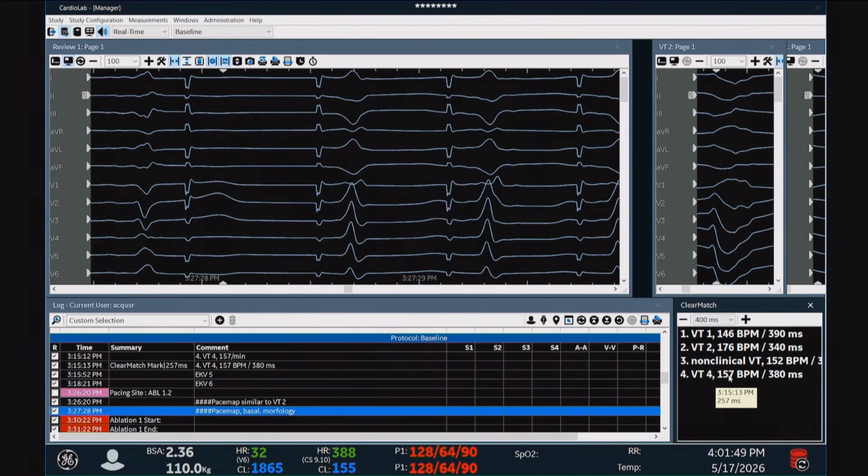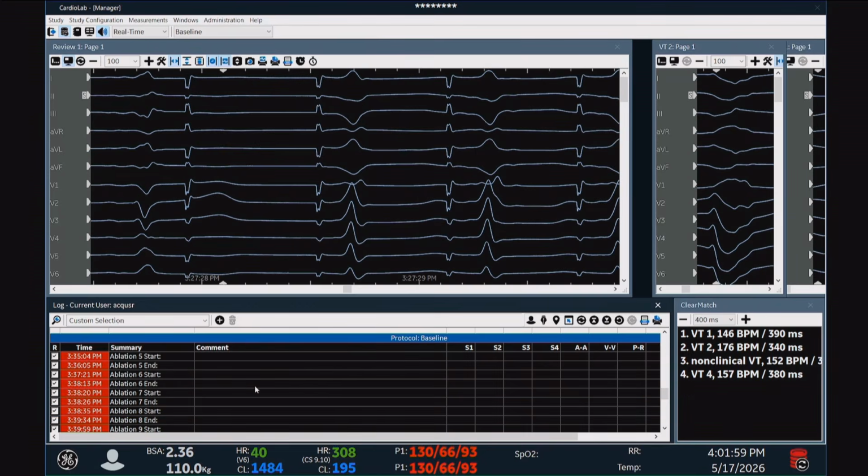And maybe then we can also show, because we decided, it was my call, Ivo said it's less elegant not to show all the functional mapping, but because the patient became really unstable, we said we have to be pragmatic, go on and start to ablate and modify the region, which is more lateral going to septal, just to make the ablation there. So maybe, Ivo, you can now comment on the VT that we induced. Maybe show the VT.